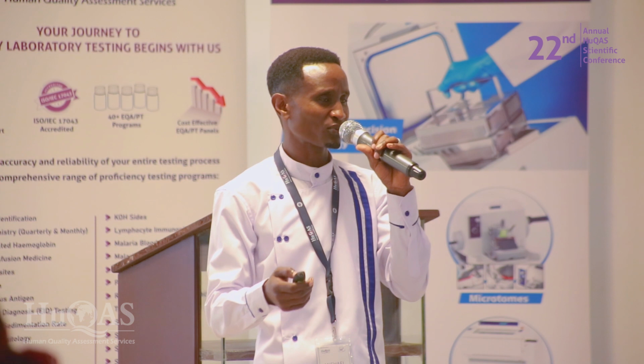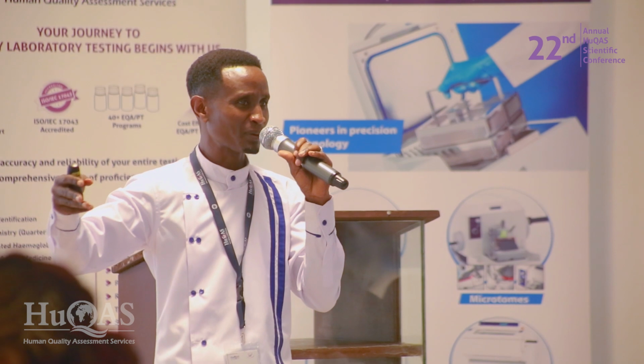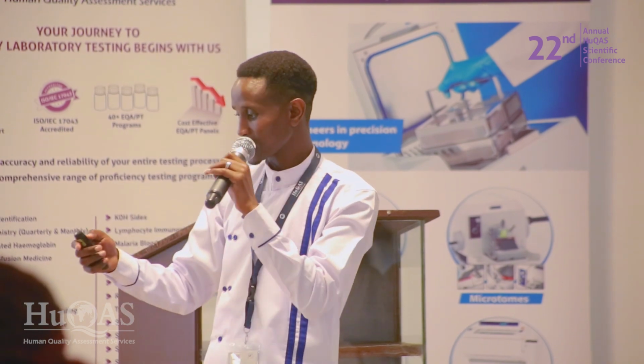For the thin films, you count infected red blood cells against total red blood cells, up to 5,000 red blood cells. So you can take the average of your counts for each field. If you have 400 red blood cells per field, you can work out how many fields you need to count to get to 5,000: around 11 to 12 fields. Are you together? That's how you can make it easier for yourself.